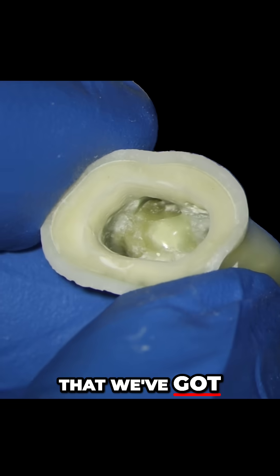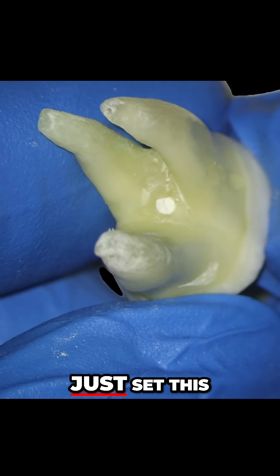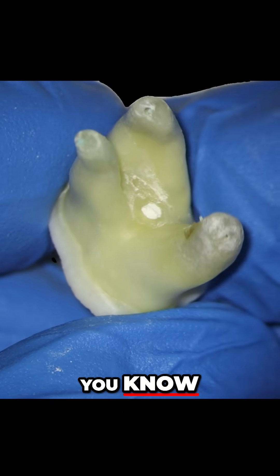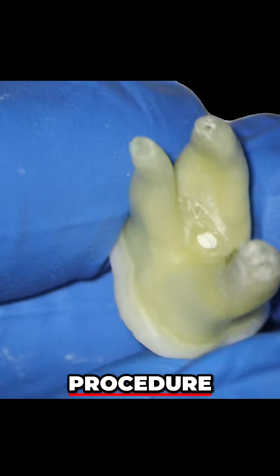We can see here that we've got the perforation on the underside of the tooth, and it's just set really, really nicely. It's got a nice little plug, and essentially we have saved this tooth with a really, really simple procedure.